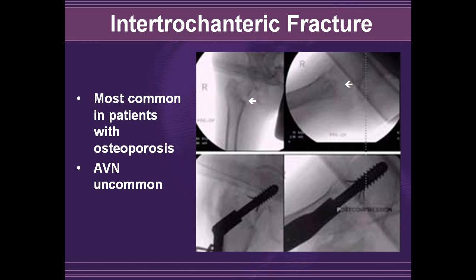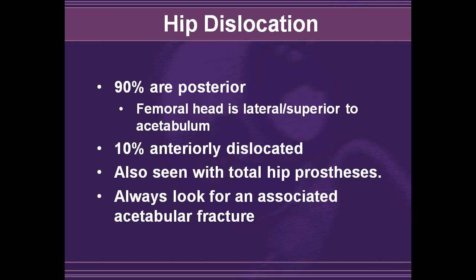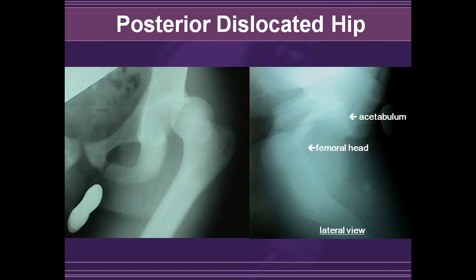Hip dislocations are more rare than shoulder dislocations. However, compared to shoulder dislocations, hip dislocations are most often posterior, whereas 10% are anterior. Hip dislocations are also much more common in patients who have had total hip replacements, and you should always look for acetabular fracture dislocation. Here is an AP view of a patient with a posterior hip dislocation where the hip is overlapping the acetabulum and is superiorly displaced. On the lateral view, you can see the femoral head is posterior to the acetabulum.